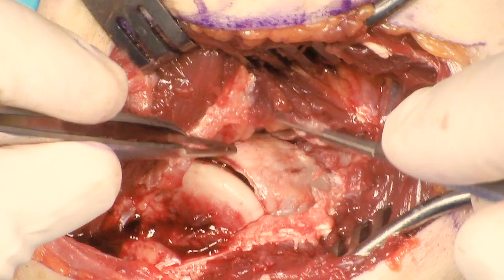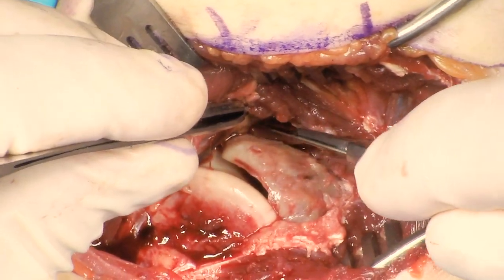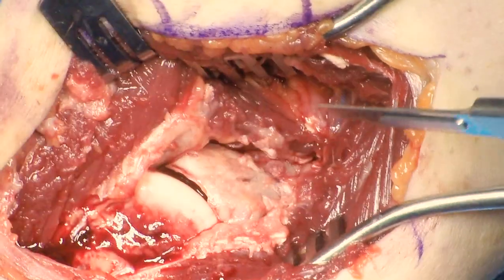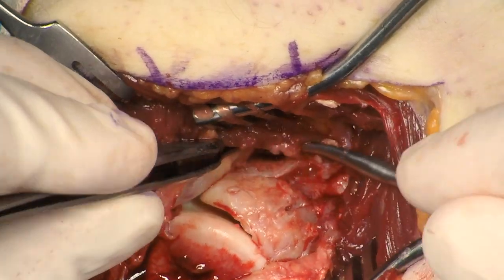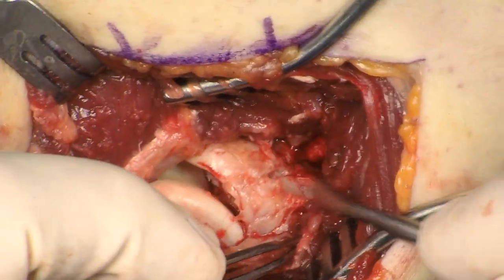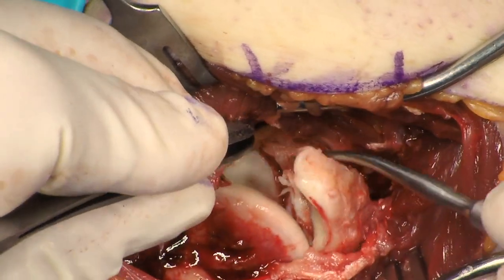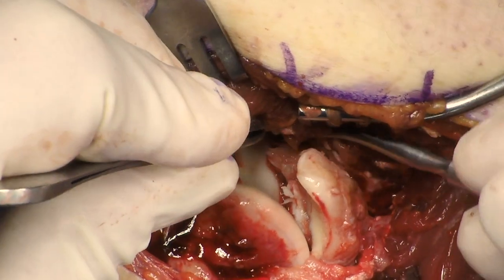Subperiosteal dissection is then taken radially on the coronoid. The extent of the comminution can be visualized. The fracture pattern is assessed. Fracture reduction can be achieved with some simple manipulation of the fragments. Temporary fixation with K-wires is not typically necessary — the plate usually reduces the fracture.